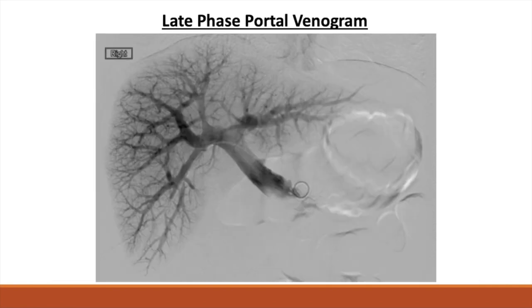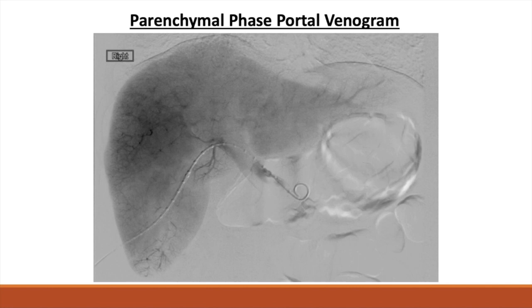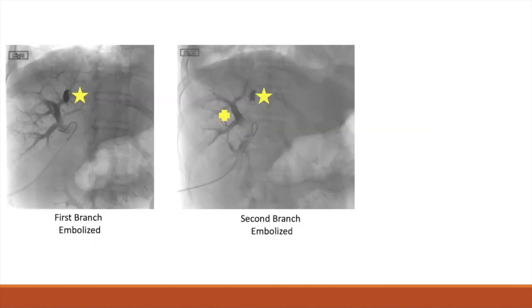This is a late phase portal venogram and this is a parenchymal phase portal venogram. Once the anatomy is confirmed, the pigtail catheter is replaced with a reverse curve catheter and all target branches of the portal vein, with the exception of the one initially accessed, are sequentially embolized. If the interventionist would like, portal pressures may also be obtained so that if evidence of portal hypertension is present, the procedure might have to be aborted.